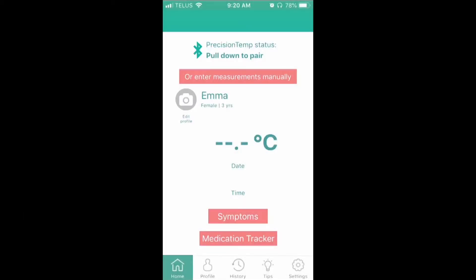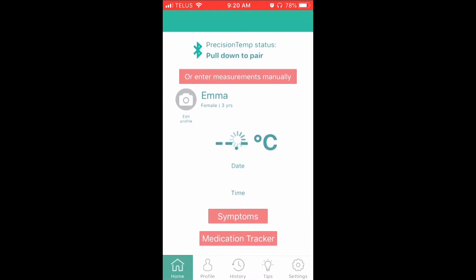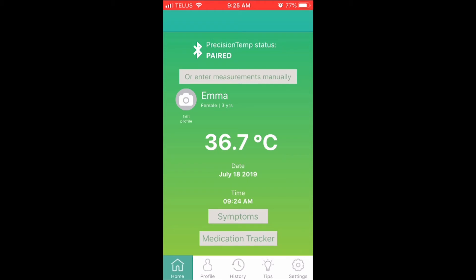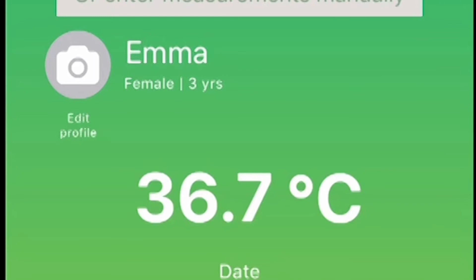On the Home screen, at the top you will see Precision Temp Status — pull down to pair. Slide your finger down the screen and the app will start to locate your ear thermometer. Turn on the ear thermometer. You will now see "connecting" at the bottom of the home screen on the app. Once connected, "pull down to unpair" will now be seen on the screen. You can now proceed to take any ear temperature reading. Once you are finished, the app will update the information under the profile of the person you are currently in. If you are taking temperature readings for multiple family members, you have to make sure you are in the correct profile in the app. Note that you cannot re-download the readings from the ear thermometer once they have been downloaded once.